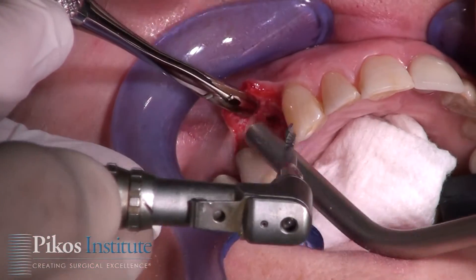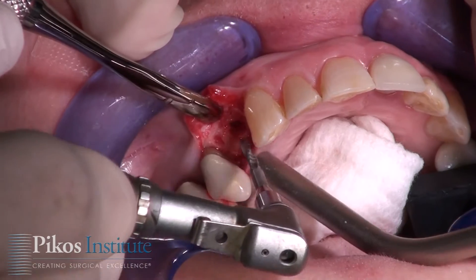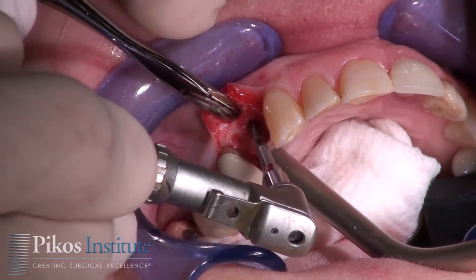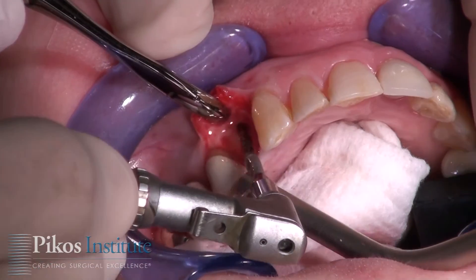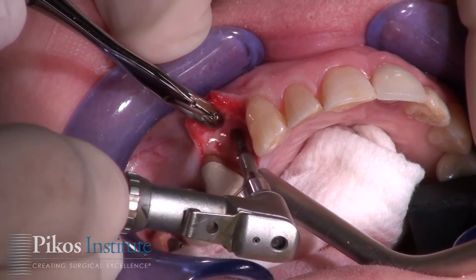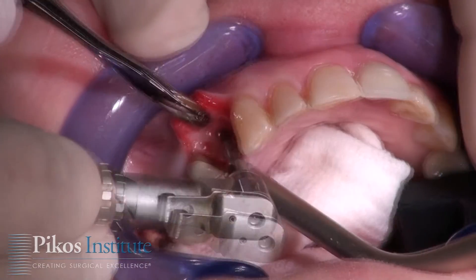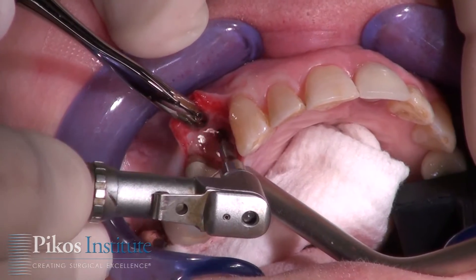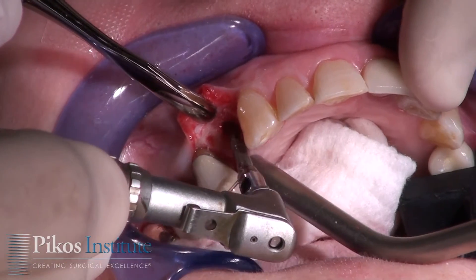Now we'll proceed with our 2.0 pilot burr — even though this is a little larger osteotomy, we need depth so we'll just continue directly. And now our 2.5.